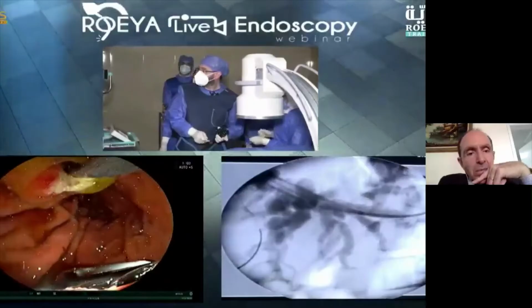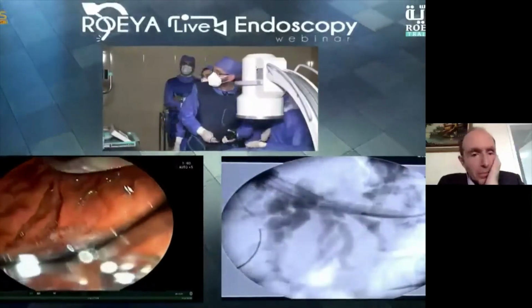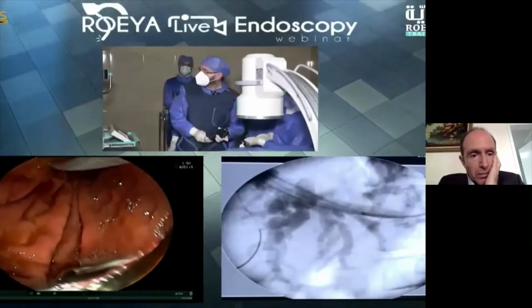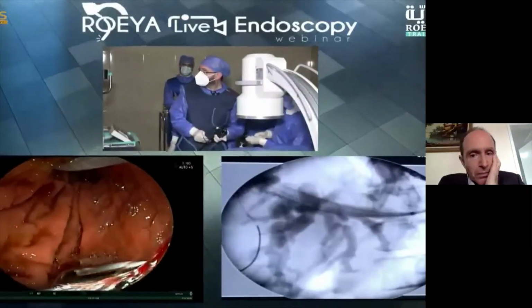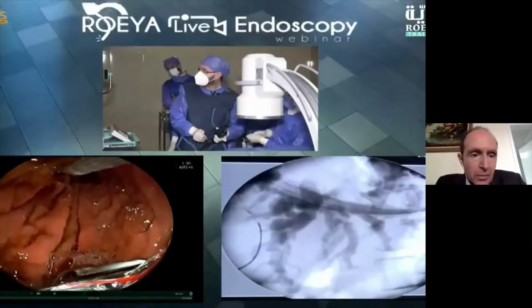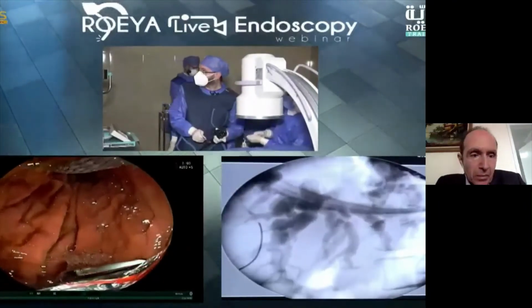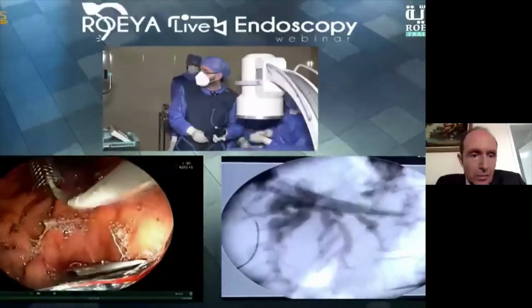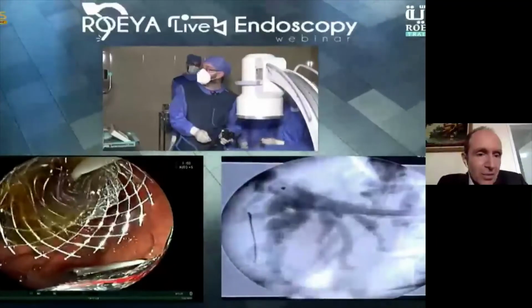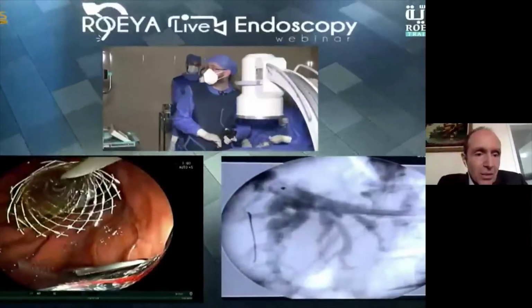Stop. I will recheck my position again. Okay. Now reopen slowly. Now we can see the stent opening inside the stomach, leaving a longer part inside the stomach with a good bile drain now. You can see the view endoscopic and fluoroscopic.